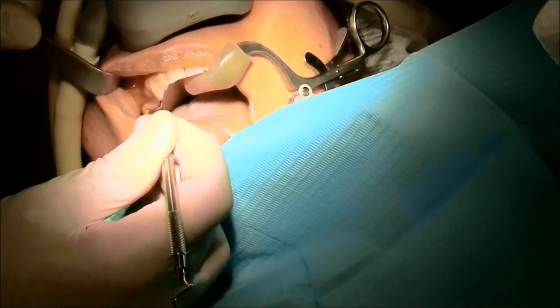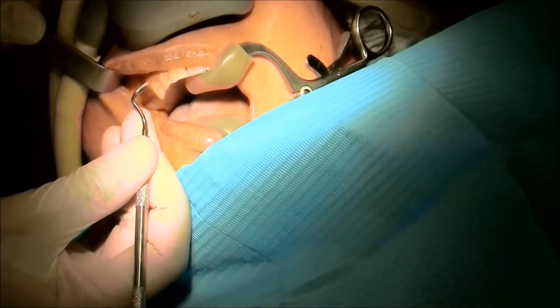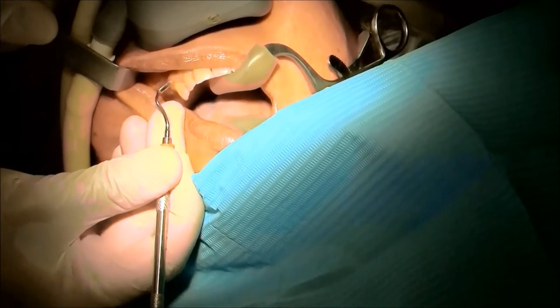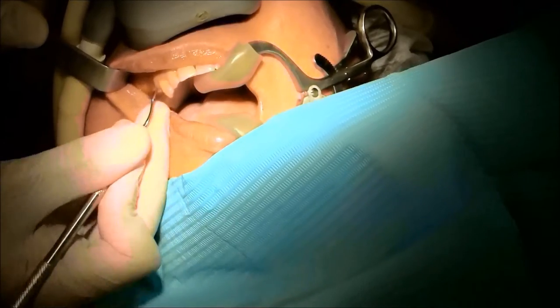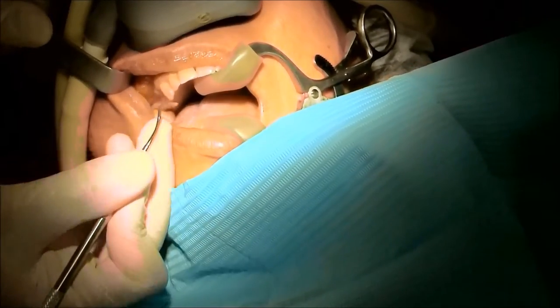This is very important for normal healing — a key step to prepare the patient for the surgery. We're removing any plaque, any accumulation, anything that might affect our surgical outcome.